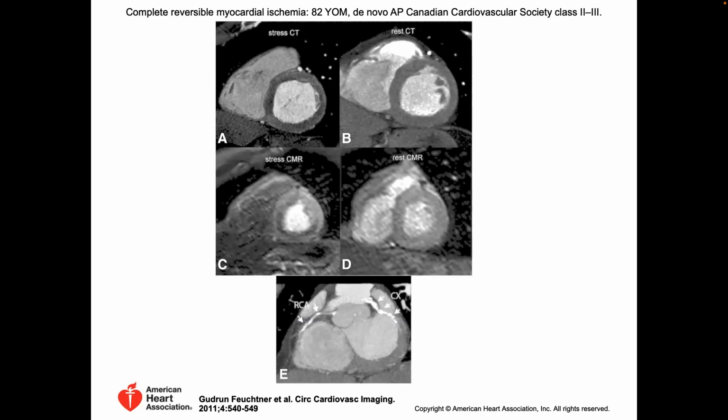In terms of what MRI is amazing at, there's two things in particular in cardiac MRI that are amazing compared to everything else. One is perfusion estimate, and the other is what's called late enhancement or infarct detection. So here's a stress CT image and a rest CT image. Stress usually means in this context the same as nuclear medicine stress. We give the patient some drug that increases the blood flow demand. And that drug could be dipyridamole, adenosine, something like that, that just opens up the vessels.